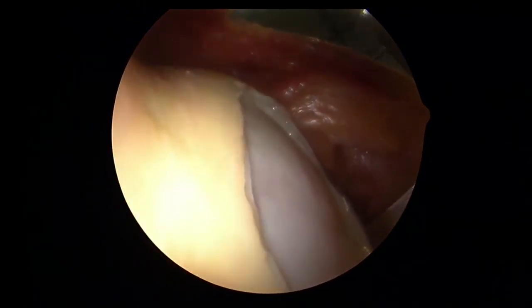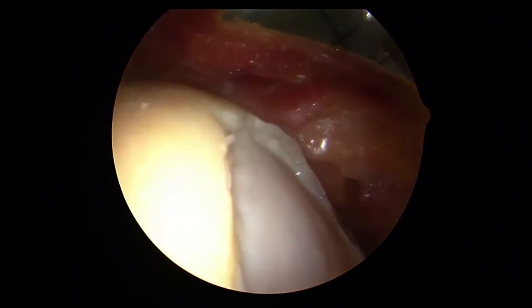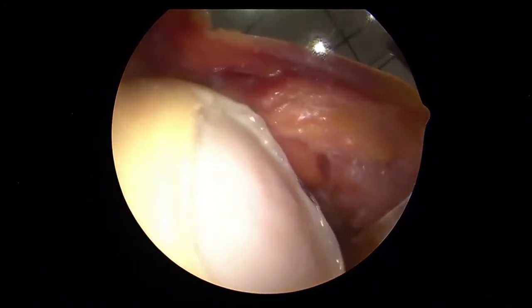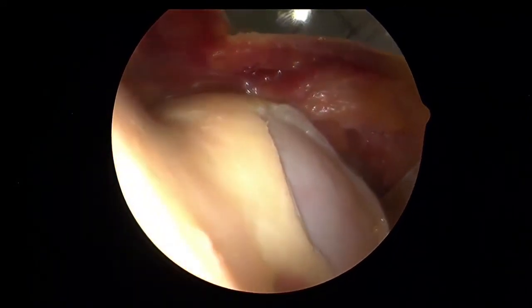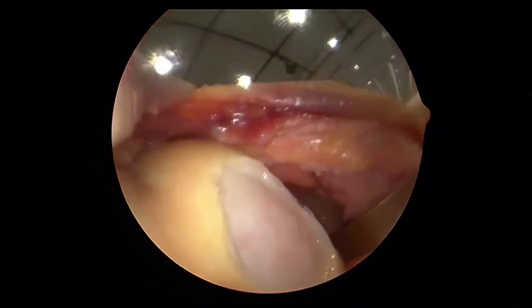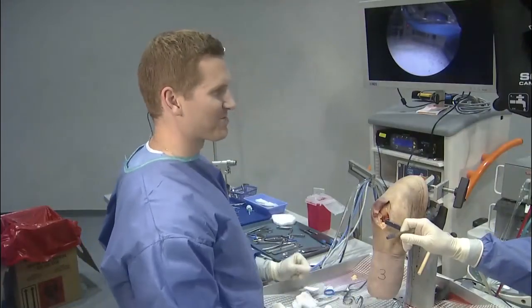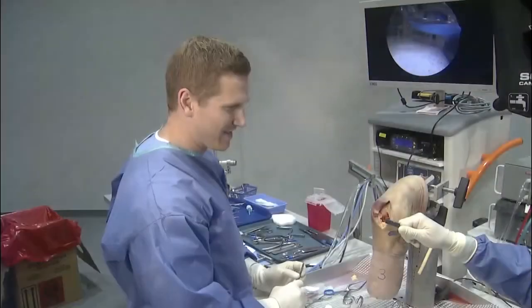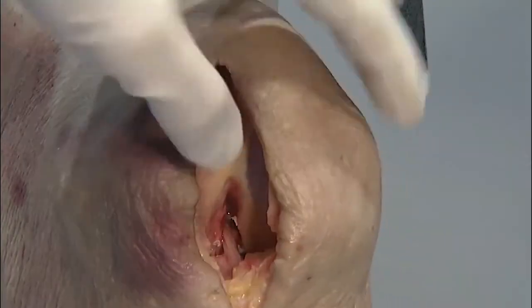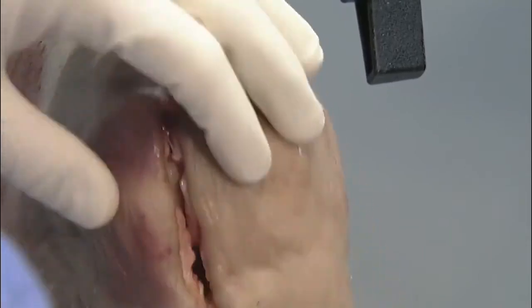So that gives me just absolute confidence with rehabilitation. Again, this will horizontally integrate to the articular cartilage, and then it will vertically mature over time. To me, that gives me a lot of confidence for the range of motion, etc. Yeah, which we're going to test. We'll just wait those 3 minutes. So I think the glue is pretty much dry. What we can do is, I just want to show you, I'm happy to take this knee through immediate range of motion.